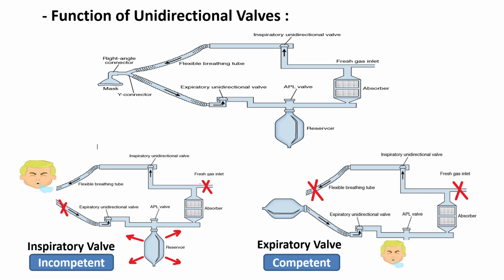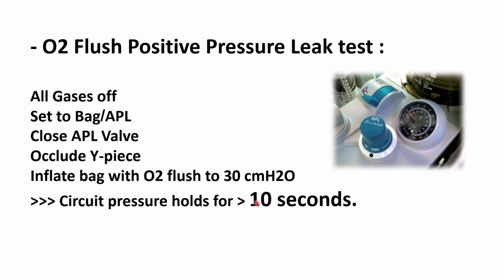Okay, checking for the oxygen flush positive pressure leak test. We make sure that all gases are off and switch the device to bag, not the ventilator mode.